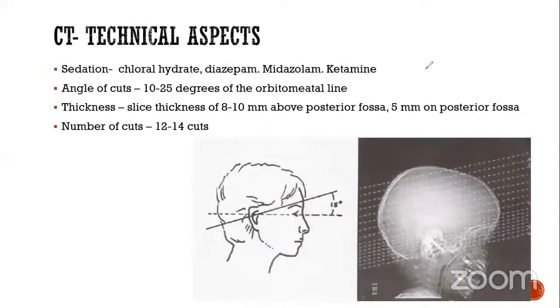Some technical aspects, that is the sedation. It is important to sedate the patient prior to the technique to prevent head movement. One of several available drugs can be used, like chloral hydrate, diazepam, midazolam, and ketamine. Sedation is contraindicated or should be given with caution in patients with potential airway obstruction, respiratory failure, severe renal and hepatic failure.